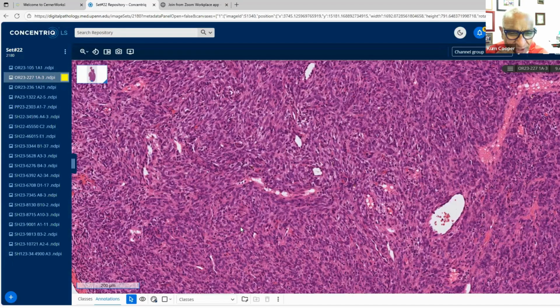and all three markers were positive. The mesenchymal markers, desmin, actin, SF1, and inhibin, as well as epithelial markers, keratin. So a nice example of a UTROSCT, and also to remind you that these can be aggressive. There was a recent paper from MassGen showing that these can recur, and not all of them are benign. So be aware of that. You'd have to do a risk stratification of these tumors. And there is a paper out there in AJSP on the risk stratification, characterizing or giving some clue to the clinical behavior of these tumors.